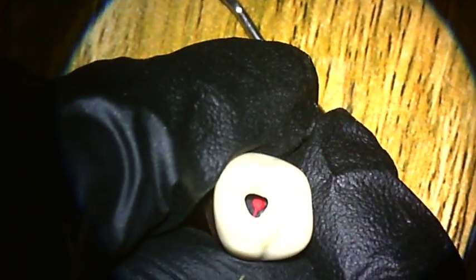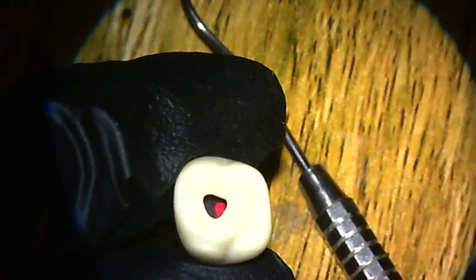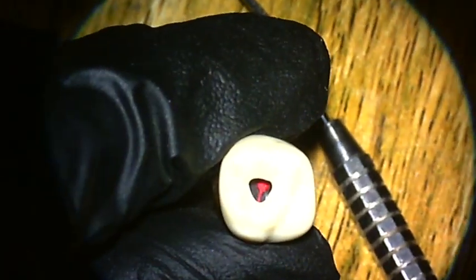A minor roughness of the cavosurface margin and all the walls is fine. By roughness we mean if there is any surface irregularity here, or if you have created a minor bevel. Ideally, you shouldn't have any bevel at the cavosurface margins, neither any zigzag or any roughness. However, if you accidentally created that, make sure you rub it out manually with any diamond burr to remove it. Thank you.